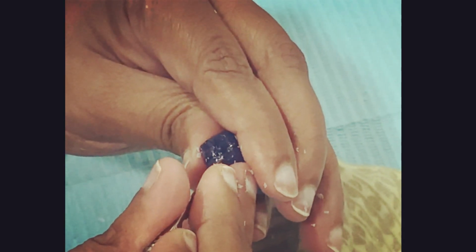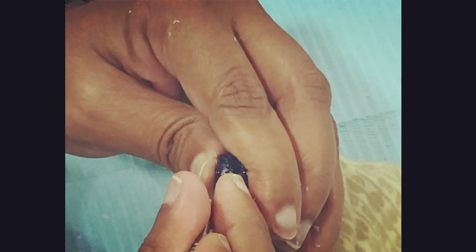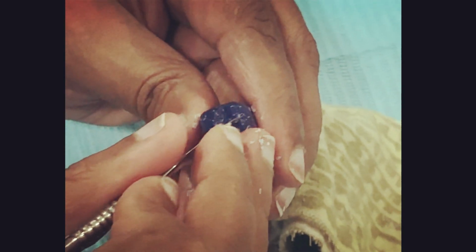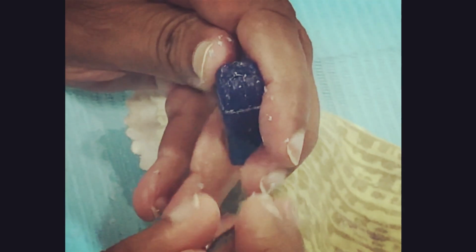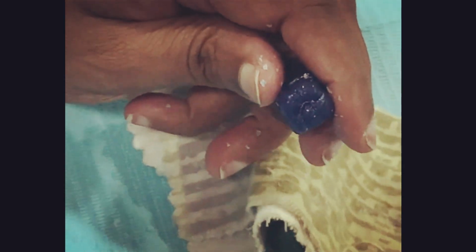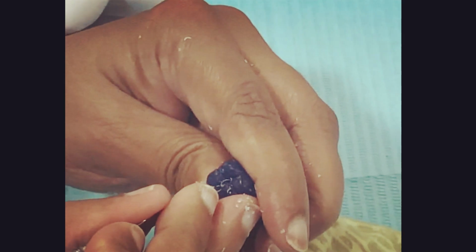And the same here. So the lingual groove connects with the buccal grooves and kind of makes a V shape. So that's what you see here, okay? So that's why we did that slant line. And the same thing you will see once I finish how the V is created. So I'm just doing that right now, okay? I'm just going around the cusps like that. And then this is the distal.